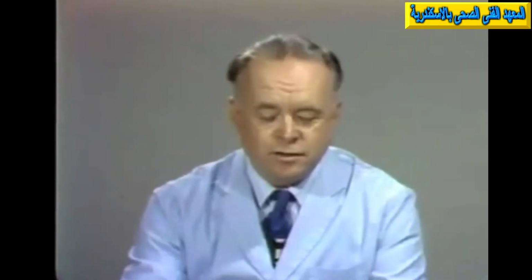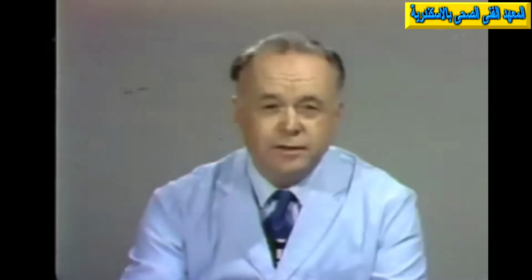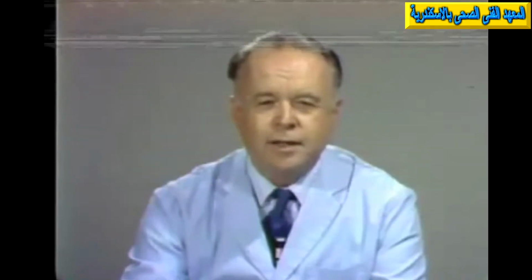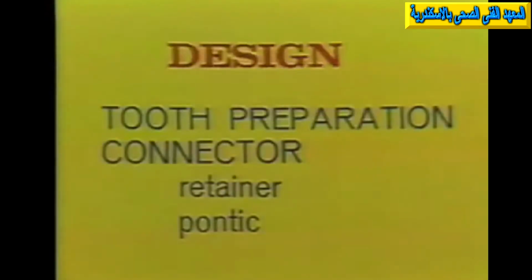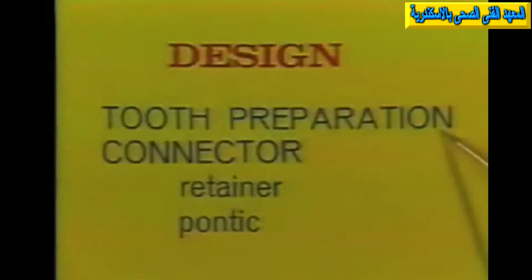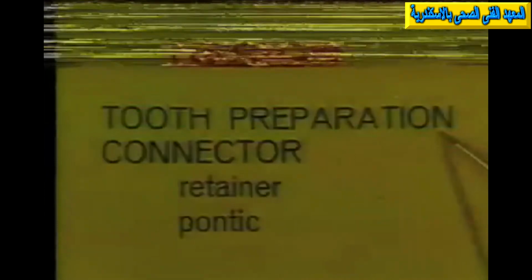We have discussed the 4 uses of the semi-rigid connector, and now we need to turn to discuss something of the design and the fabrication of the semi-rigid connector. It's important in using a semi-rigid connector to begin the design sequence at the time the tooth preparation is being done. So we have to regard tooth preparation as part of the designing of the semi-rigid connector.